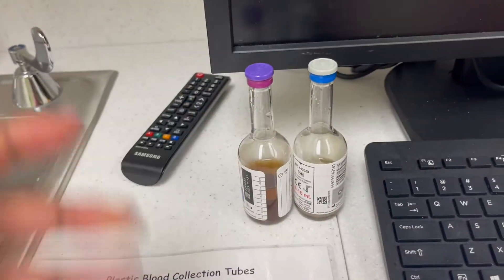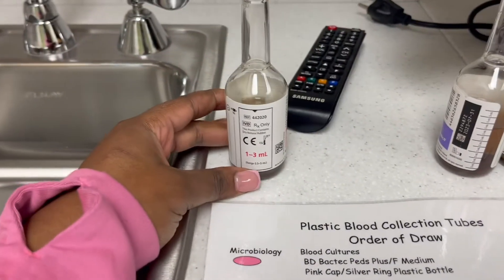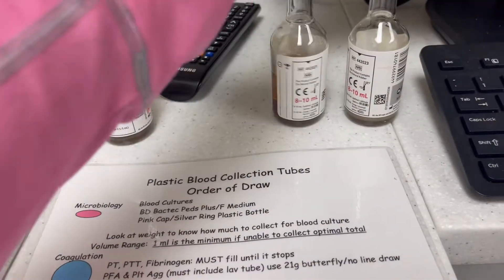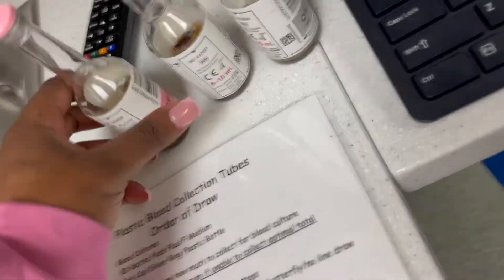Since this is a pediatric hospital, for little kids you may just need one. You can put one to three ml's in this one, and you can do eight to ten in this one. So that's first.